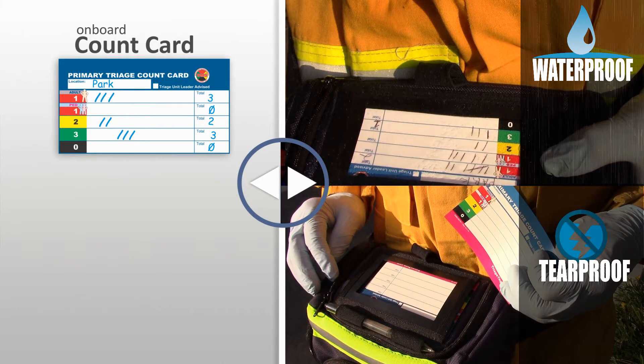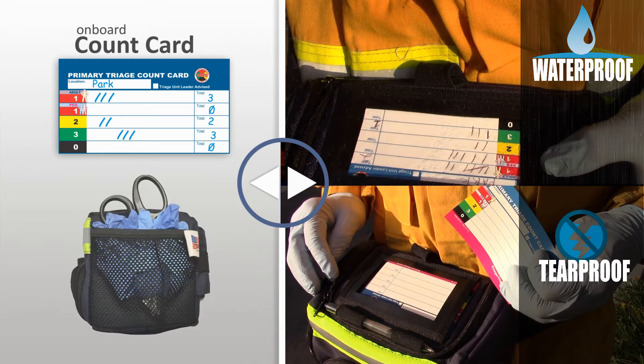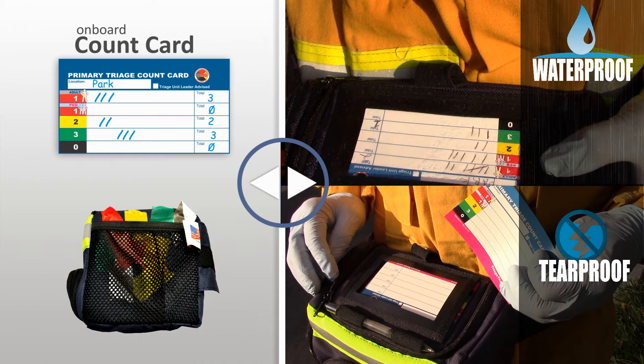Of significant importance is the count card's pediatric feature that allows MedCom to obtain and allocate specialized destinations early on. In the unlikely event the dispenser's two pens experience a catastrophic failure, the side mesh pocket may be utilized as a ribbon tip holder. However, the pediatric count and after-action count card documentation benefits will be lost.